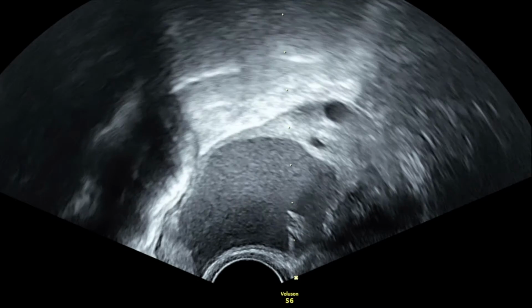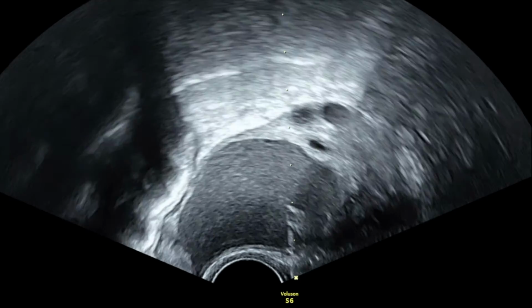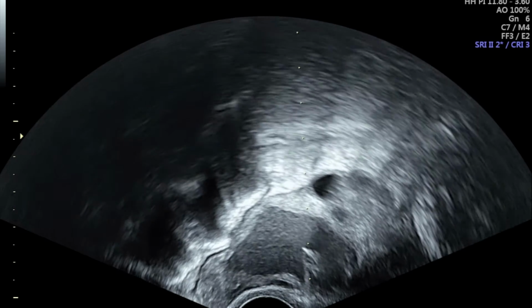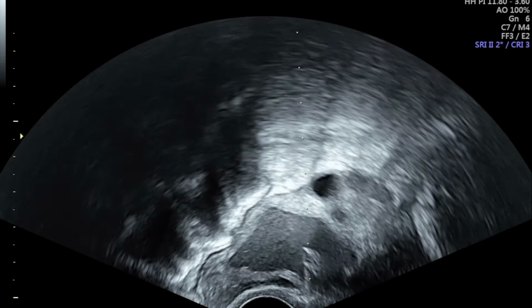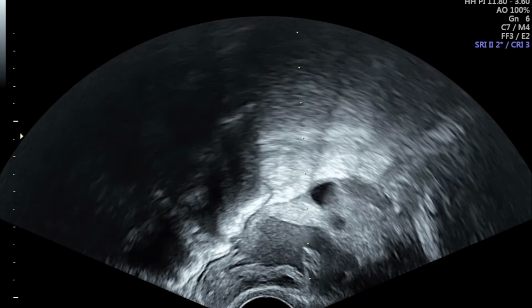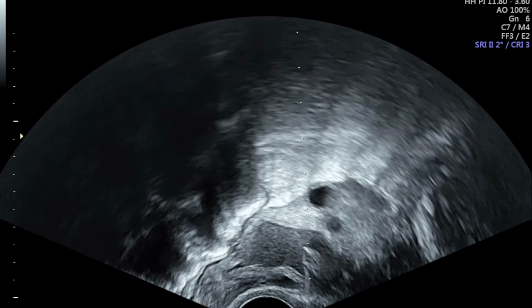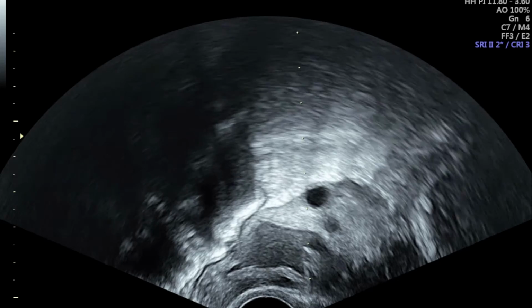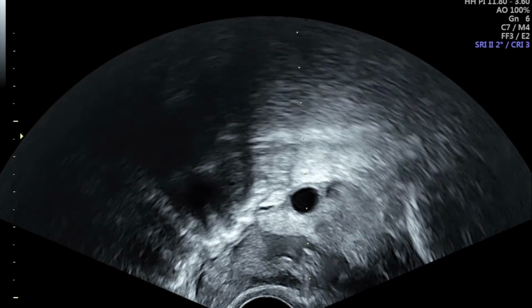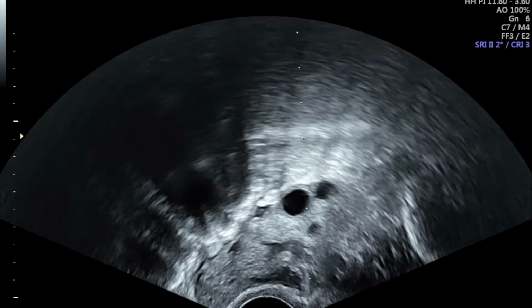It is possible to perform sclerotherapy on cysts measuring up to 100 millimeters, but patients are informed of the risk of failure, especially when the endometrioma is a long-standing one. In this case, it can contain solid clotted parts, which cannot be aspirated. In case of failure, a laparoscopic cystectomy may be offered. If the patient has been informed accordingly and is willing to, the laparoscopy can be done during the same time.